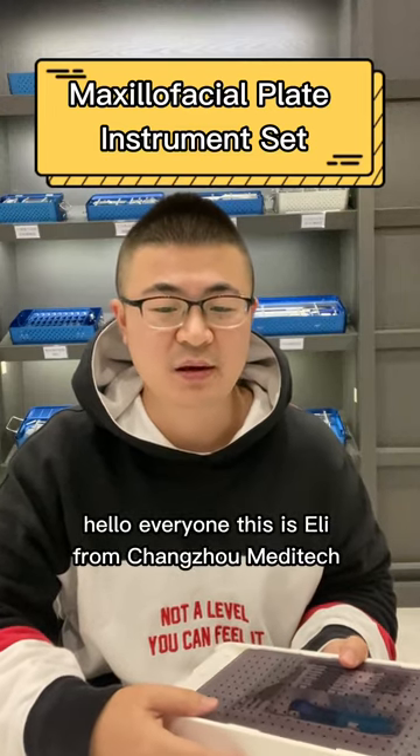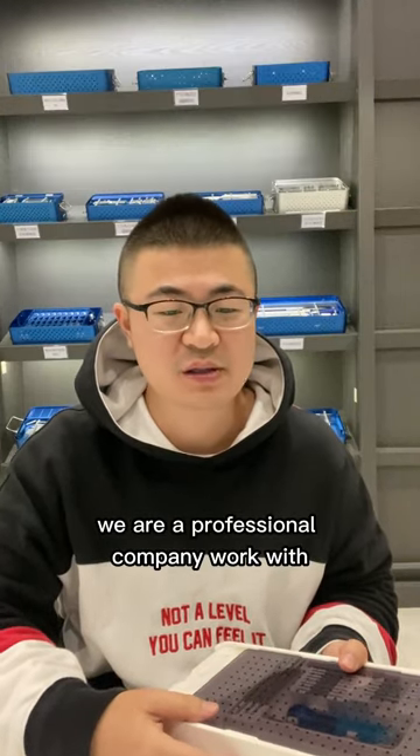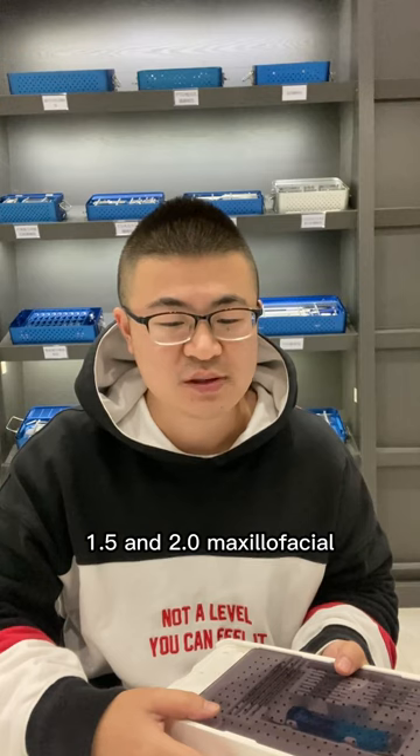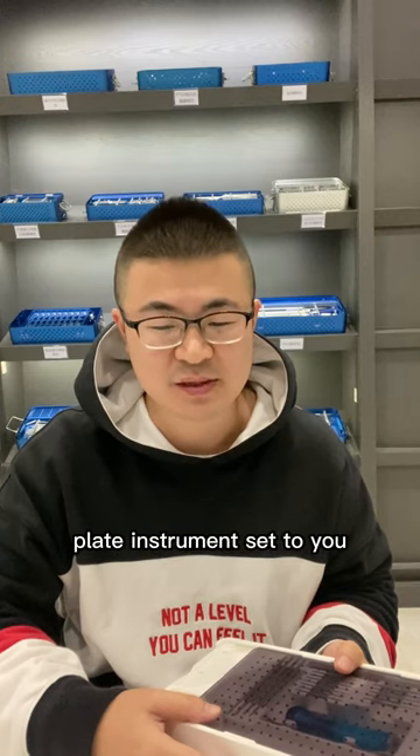Hello everyone, this is Eli from Changzhou Meditech. We are a professional company working with orthopedic implants and instrument sets for 12 years here in China. Now I will introduce our 1.5 and 2.0 maxillofacial plate instrument set to you.